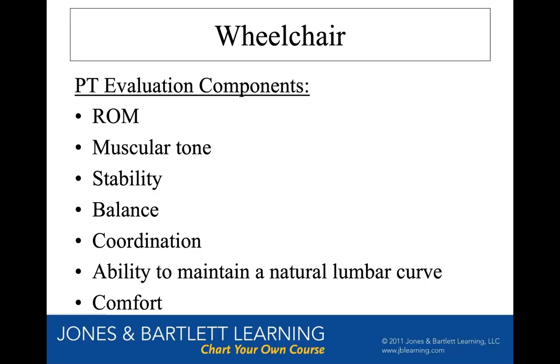Okay, so when somebody is getting evaluated for a wheelchair, it's usually done between a PT or an OT and an equipment vendor. And usually the equipment vendor has gone through certain training, and they have a designation behind their name, which is ATP, and it stands for Assistive Technology Professional.